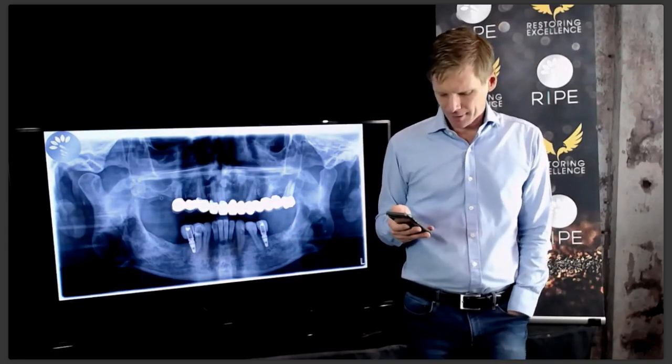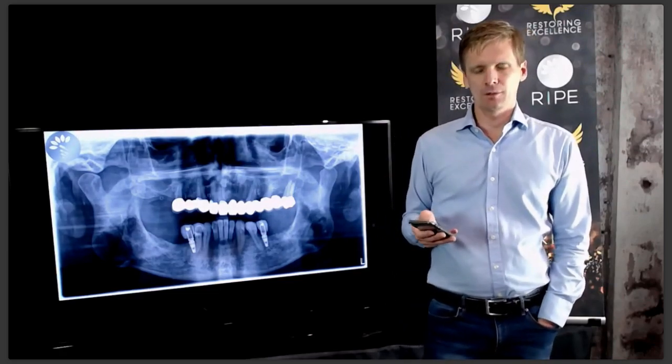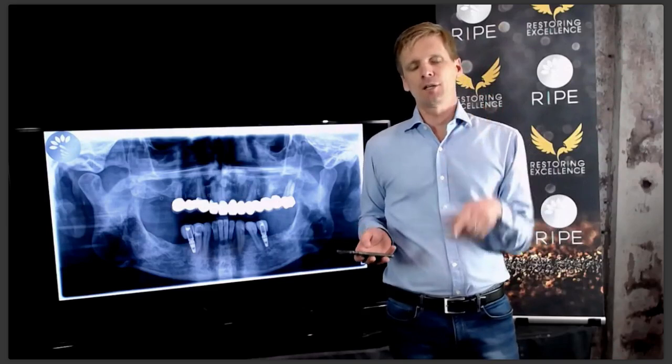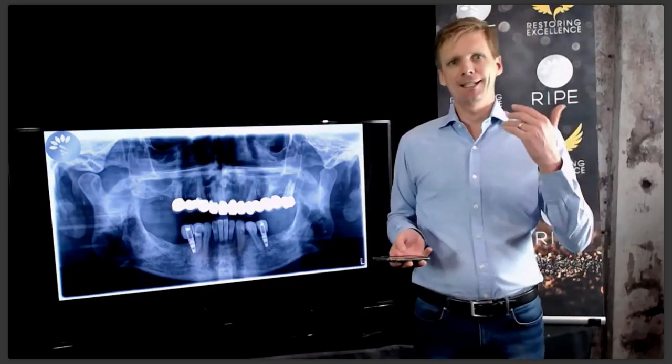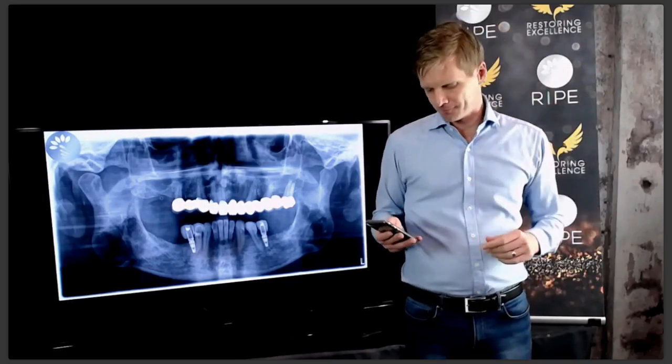With full mouth cases, you don't want to be doing massive adjustments, so think about why you've got big problems. But otherwise it's the same. If you're adjusting porcelain, it's the same. You jack them up with a leaf gauge until one tooth touches on the back, and then you adjust it a little bit, and then you drop them down and you adjust it on the next spot until the front teeth touch.